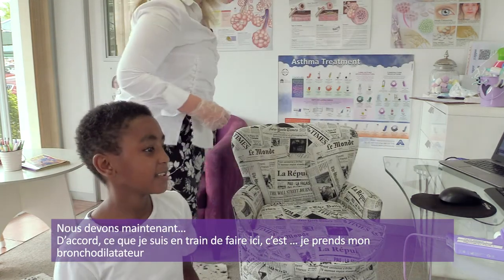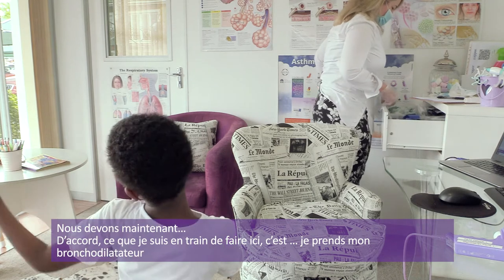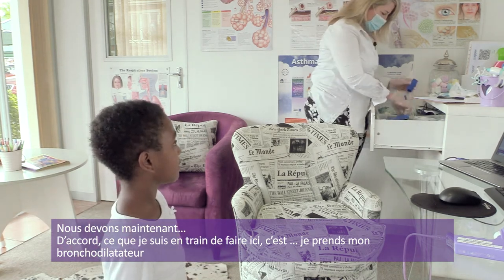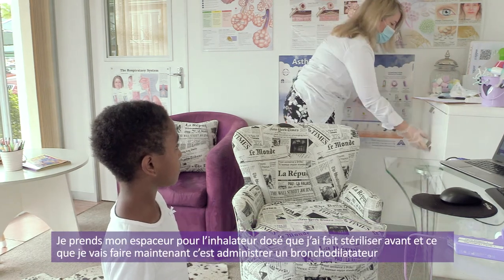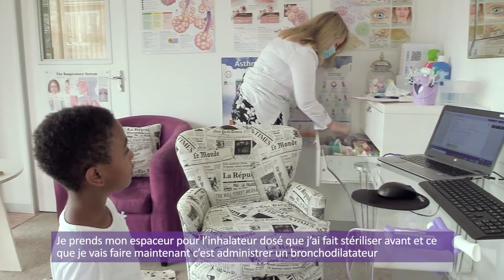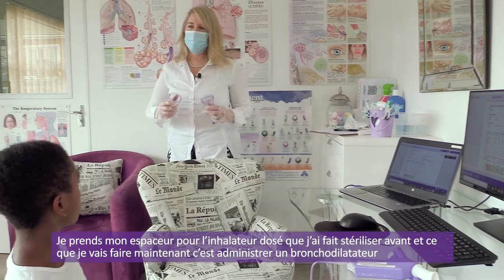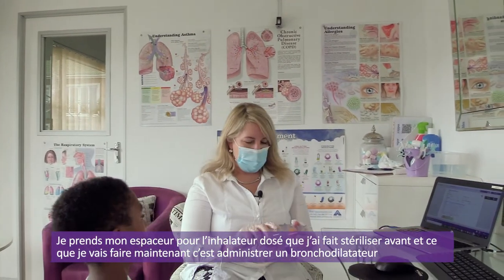Okay, so we now need to... Okay, so what I'm doing here now is I'm getting my bronchodilator. I'm getting my metered dose inhaler spacer device, which has been sterilized previously. And what I'm going to do now is administer a bronchodilator.